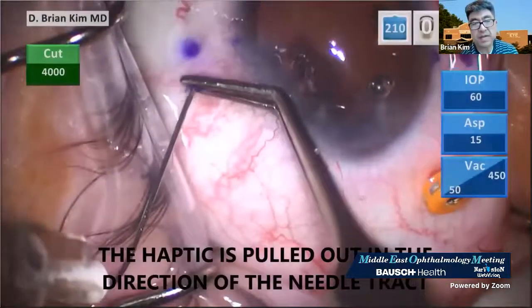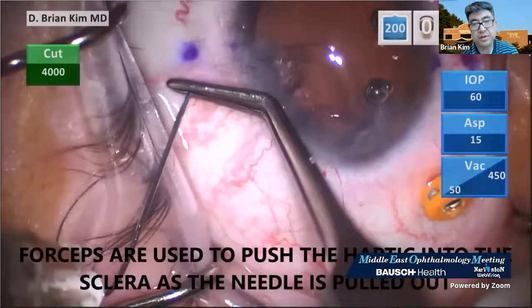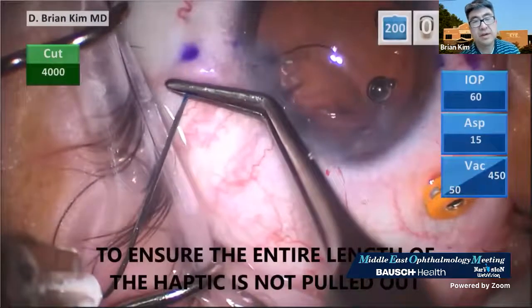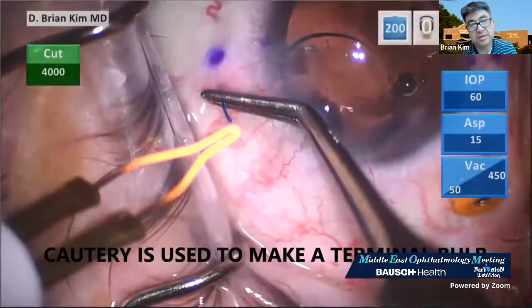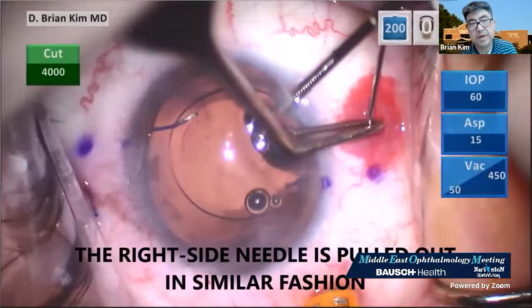The haptic is pulled out in the direction of the needle tract, and forceps are used to push the haptic into the sclera. I try to avoid externalizing too much of the haptic. And then you cauterize the tip, and you do the same thing on the other side.